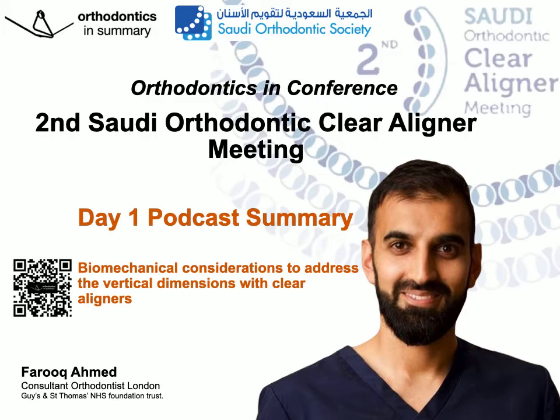Next was attachment design. This is a fundamental component of use of aligners, and he broke it down quite nicely. So the founding principle of the attachment design is that it should be perpendicular to the force that we want to achieve. So, for example, if we have a palatal incisor, we want to rotate the tooth mesially. Now, the force has to be perpendicular, so the attachment design should therefore be a long vertical attachment.